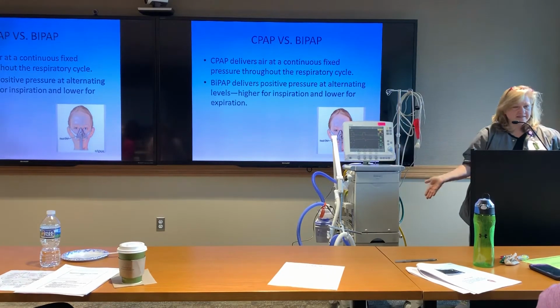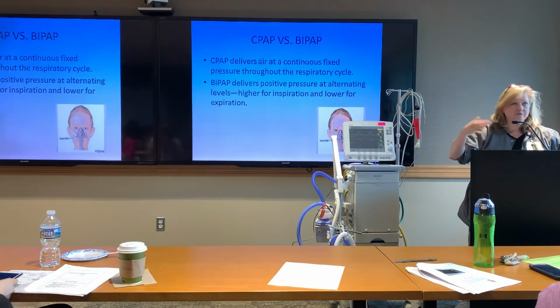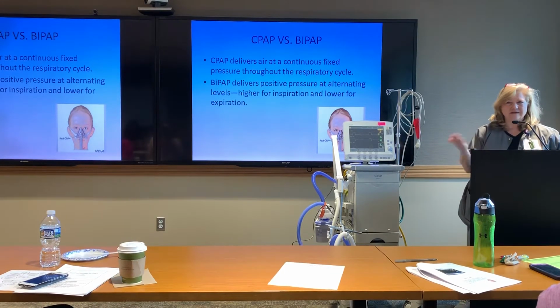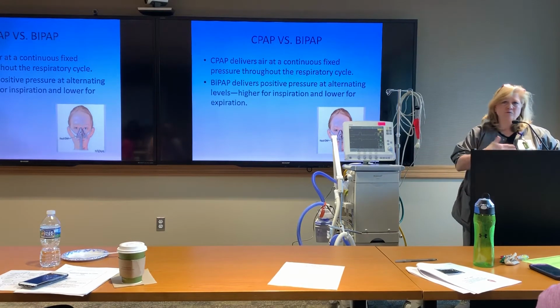So if you're on the V60, your IPAP is the pressure it's going to go to. If you're on the servo, you set a pressure support setting instead of an IPAP, and it's different. It's going to be 5, whatever the PEEP is, higher than what it would have been on the V60. Okay. It almost doesn't really matter as long as you have a tidal volume goal that you're going to titrate to, to maintain tidal volume and a respiratory rate. Titrate to maintain tidal volumes greater than 350. Titrate to keep your respiratory rate less than 30. That's really what we want to have on the patient.